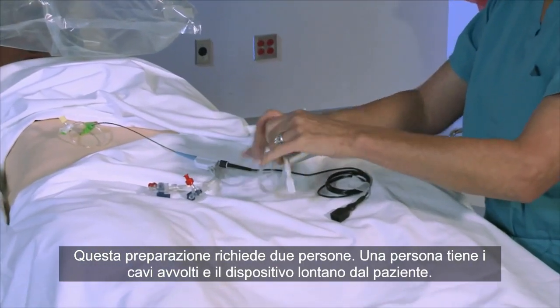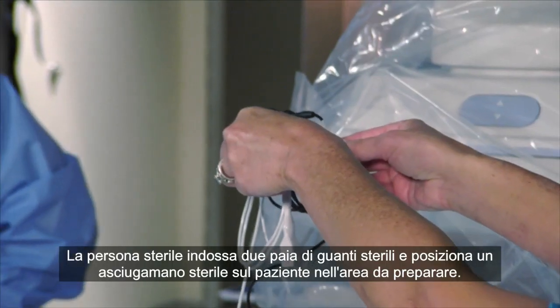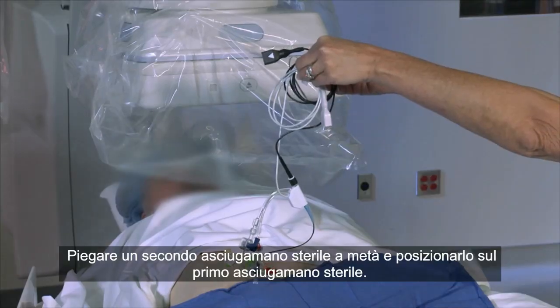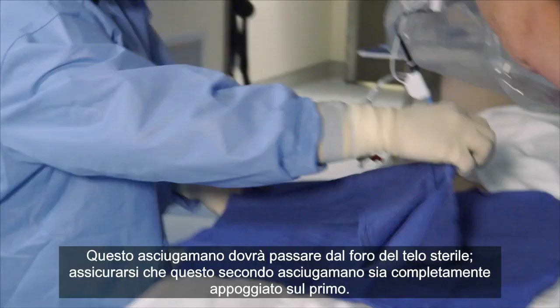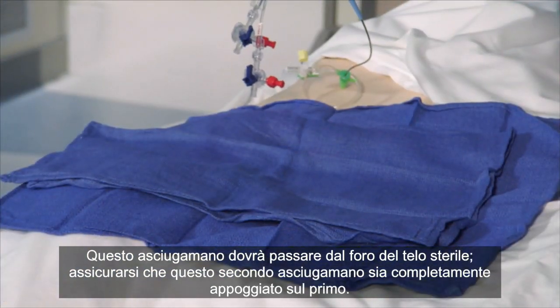This prep requires 2 people. One person holds the coiled wires and device away from the patient. The sterile person dons 2 pairs of sterile gloves and places a sterile towel on the patient in the area to be prepped. Fold a second sterile towel in half and place it on the first sterile towel. This towel is going to be pulled through the eye of the sterile drape. Make sure that this second towel is fully resting upon the first sterile towel.